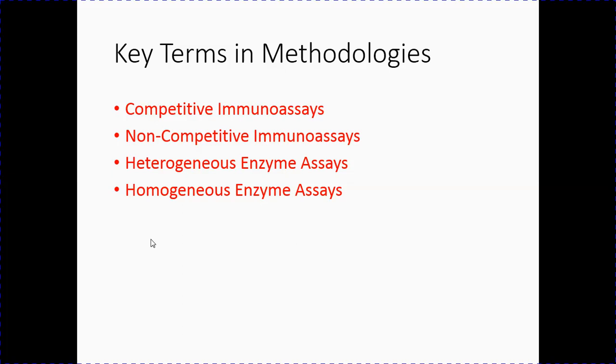So we'll talk about the specifics in just a minute, but in general, we term the immunoassay reactions as either competitive or non-competitive. That's kind of our most important cut. Competitive refers to adding whatever you're looking for. So let's say, for example, you're looking for an antigen to see if the patient has an antigen. You're going to add both the patient antigen and a labeled known antigen of what we think we're looking for. So if you were looking for HIV, you would probably not use this test method, but let's pretend you were. If you were looking for HIV, you would add a labeled HIV, and then you'd use reagent antibody to monitor how much labeled antigen is bound to the antibody versus how much of the patient antigen is bound.